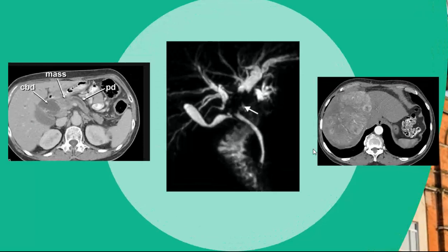Malignancy presents with symptoms of biliary obstruction or hepatic congestion. Tumours may be primary, most commonly hepatocellular carcinoma or cholangiocarcinoma, metastatic, or directly extend from an adjacent organ. The role of imaging in these cases is to identify the tumour, assess involvement of the biliary tree, and to detect the patency of the hepatic vasculature.